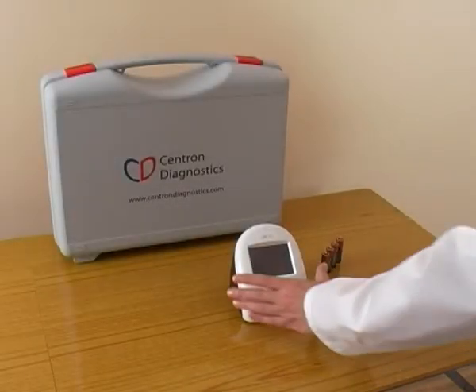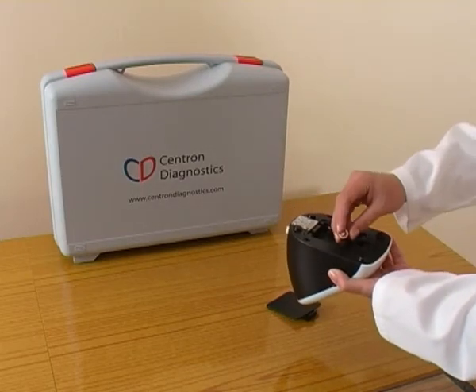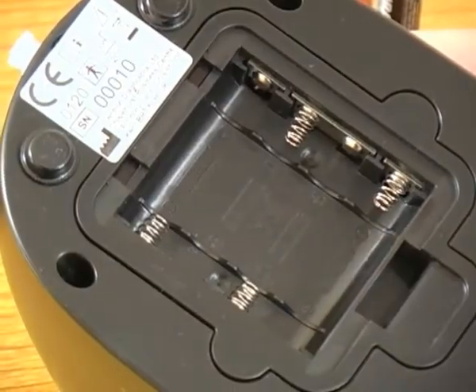To prepare the unit, insert the lithium batteries with the correct polarity as indicated on the inside of the battery compartment.